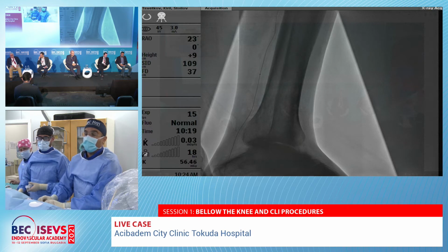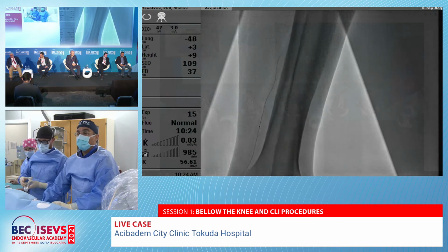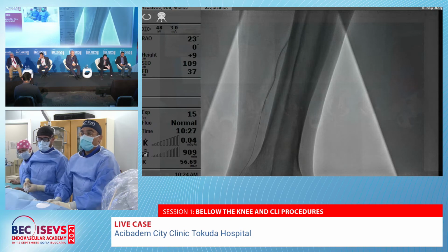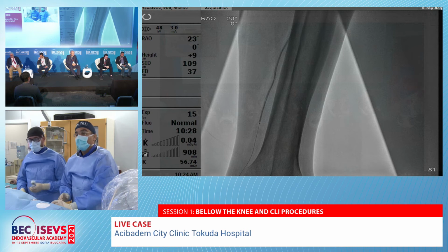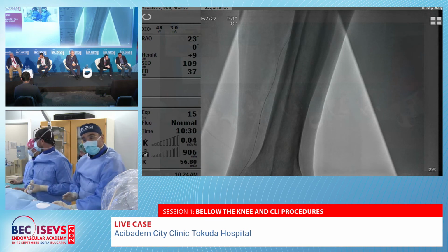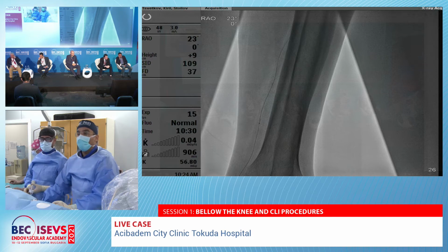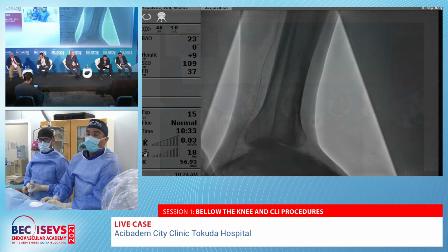The nice trick of Nikolai is that he opened first. That means it makes a channel. Okay, let's open again. Okay. Try to straighten the balloon. Okay. Perfect. Down. So the balloon is what? Sorry? The balloon is 2 point what? The length? 2.150. Okay. Well, 140, sorry. Let's go further. Okay. It gets better.